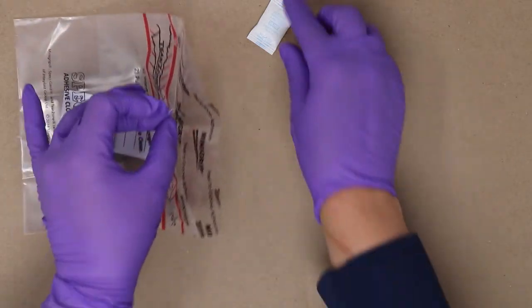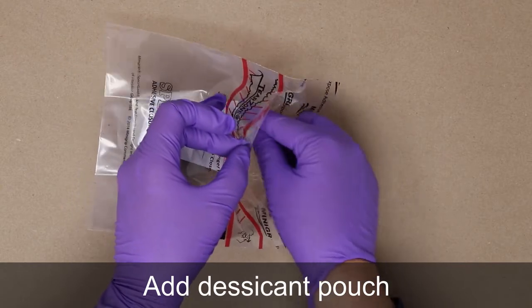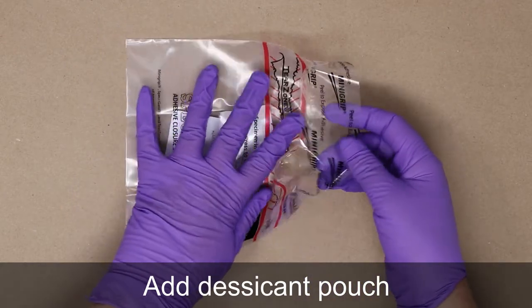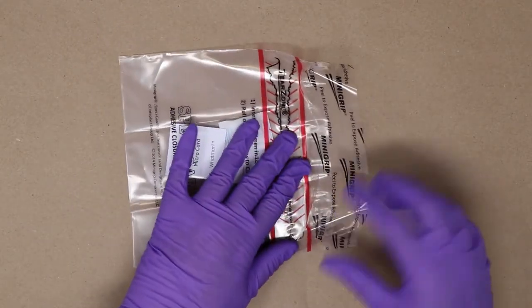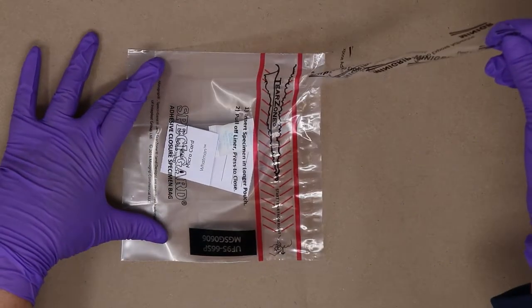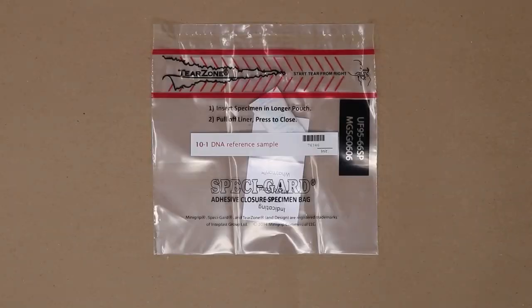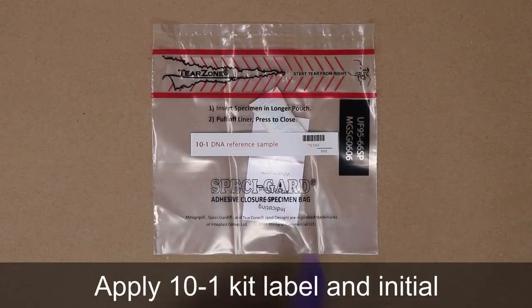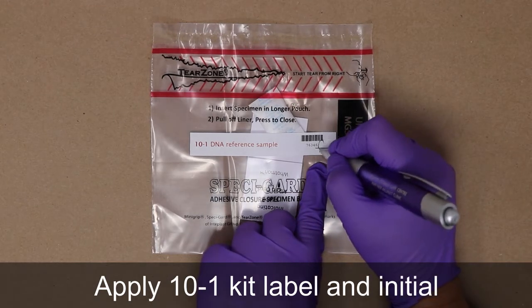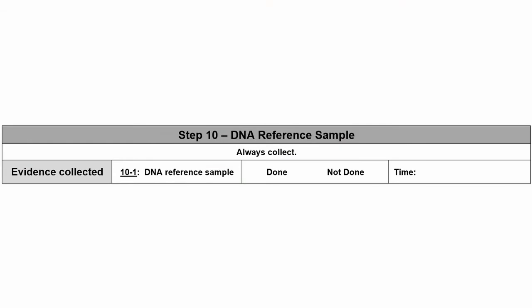The desiccant pouch provided should also be added to this bag, as it aids in the drying of the sample on the FTA card. The pouch can then be sealed. Label 10-1 should be added to the sample and initialed. The paperwork for this section can then be completed by circling done and including the time of collection.